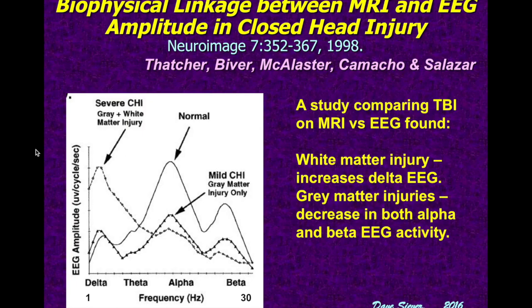In this example of brainwave activity, an EEG, electroencephalograph, we see normal activity. Notice the peak right here. This peak is at 10 hertz in the alpha band. And then we have another peak in the mid-20s, around 22 to 28 hertz in the beta band. This is a pretty standard healthy EEG. Notice how the theta and delta is indeed quite low.